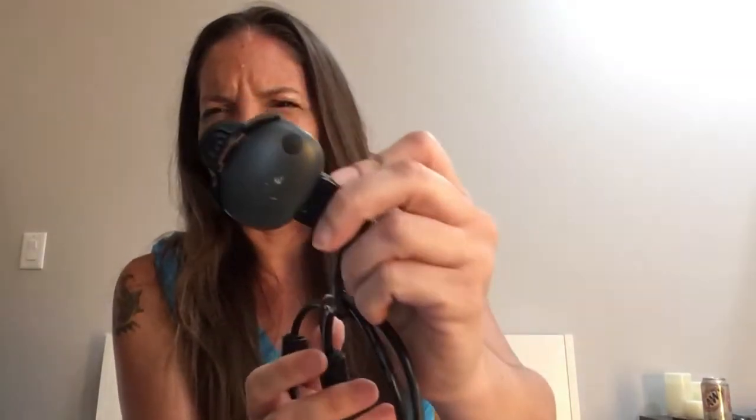I was going to show you really quick how you put it on and kind of what it was. Here is my transmitter. And in here, this is my G6, and in here you can actually see the suntan line. That's where they've implanted the sensor. So in order to get a reading, the first thing I have to do is attach my transmitter, and I'm going to have to place it over top of the sensor.